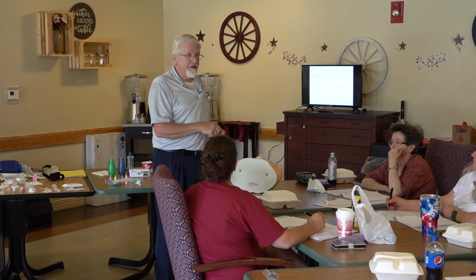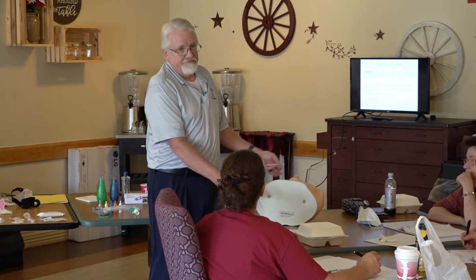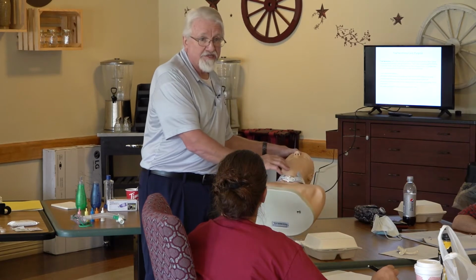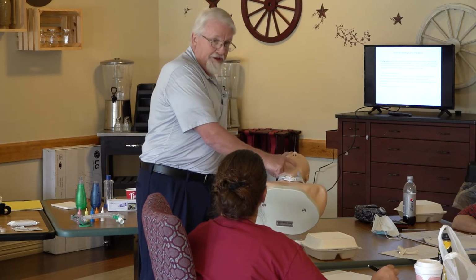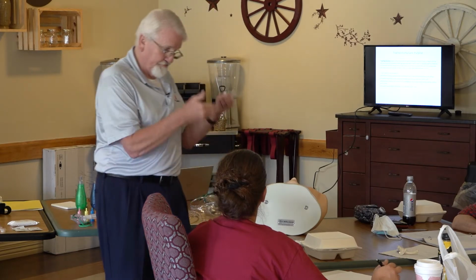Okay. Then, yes. Does that make sense? Right now, it doesn't matter. If he drops, I'm going to slip the mask up wherever I am in the process. If I see 90, he started at 98 and now I see 88, it's going back up on there until whenever he comes back up.